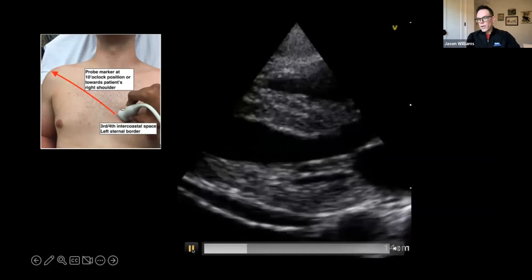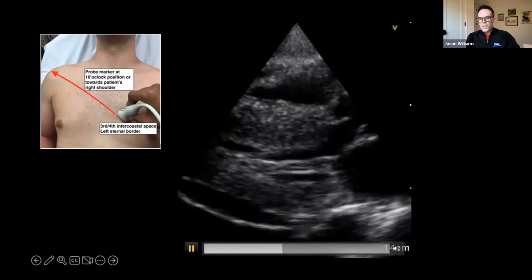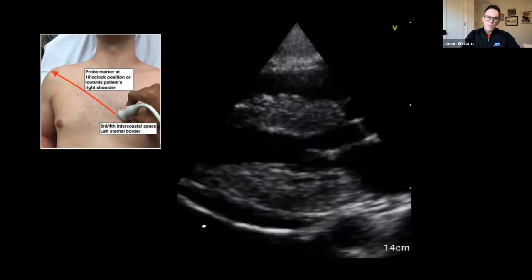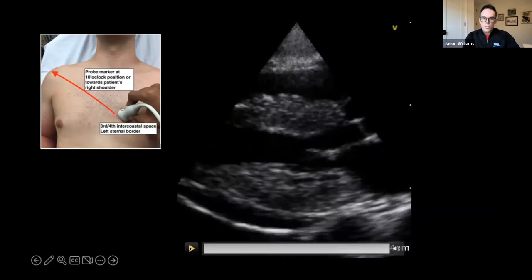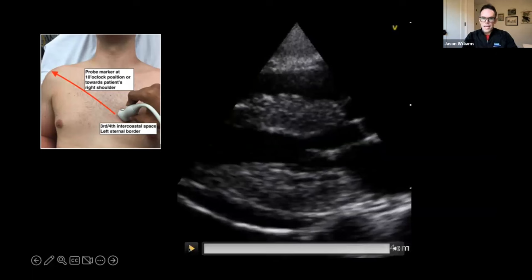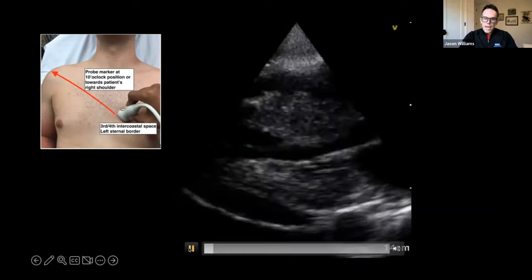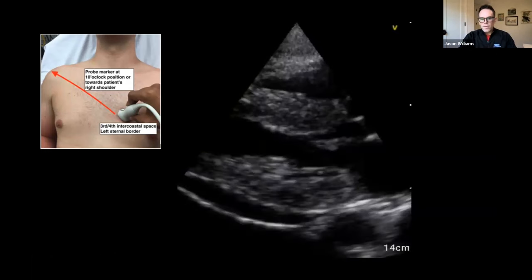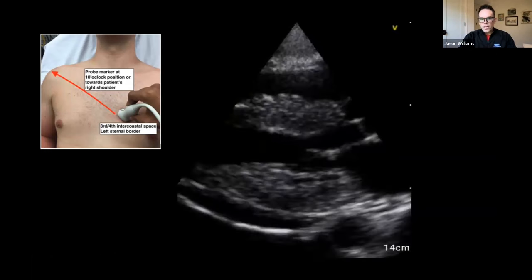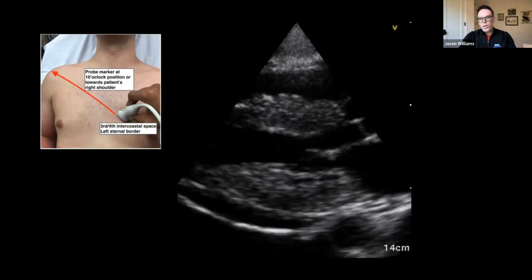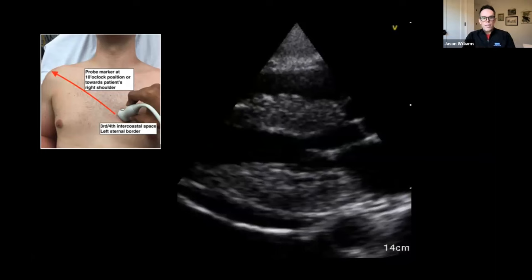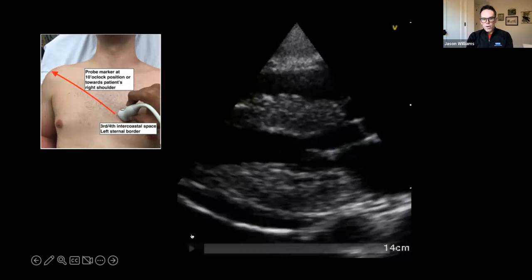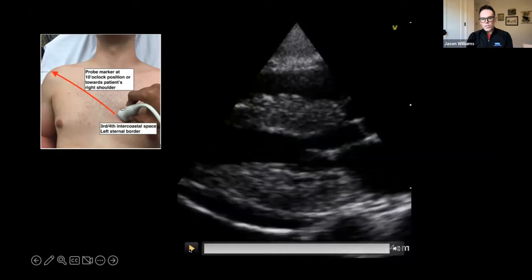The other thing I asked myself is how's the right heart doing? And so you don't get a great view of the right heart. Nidhi, if you could kind of circle it there at the top, that black anechoic structure, perfect. And so I kind of look at the North South diameter and kind of compare that to the size of the aorta and the size of the left atria. And you can almost draw a line on the right side of the screen and along the right side of the screen, it should be one third right ventricle, one third aorta, one third left atria. And if you have a dilated right ventricle, that little black sliver is going to be much taller and take up more space on the screen, but it really looks normal, normal size. The rule of thirds seem to apply here. So I don't think there's any severe right ventricular dysfunction.